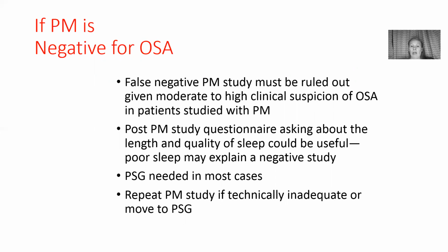And remember how we talked about how an AHI is going to be more accurate in an in-lab study. So it's very important to always ask the patient about their sleep. You may need to repeat the study if they didn't get a good sleep, or the doctor might say, just bring them into the sleep lab.